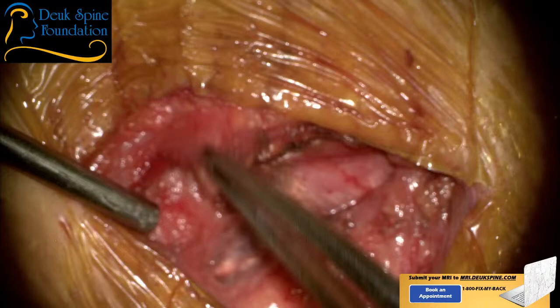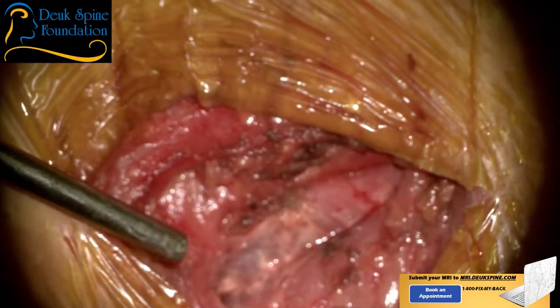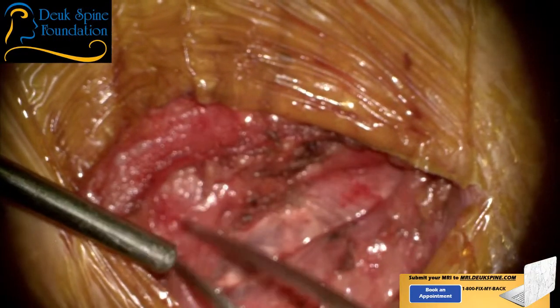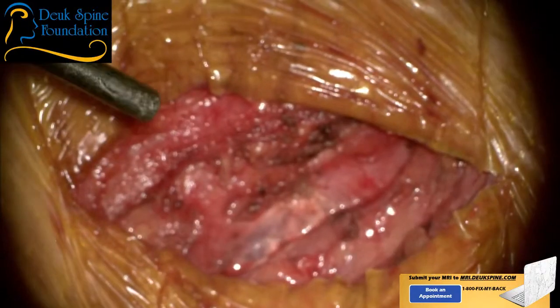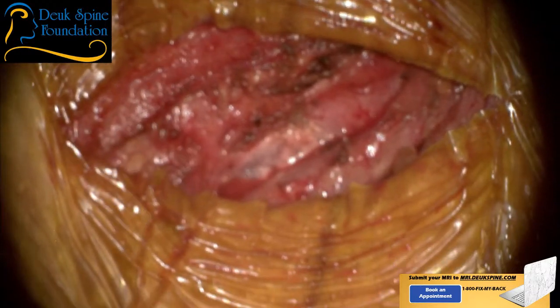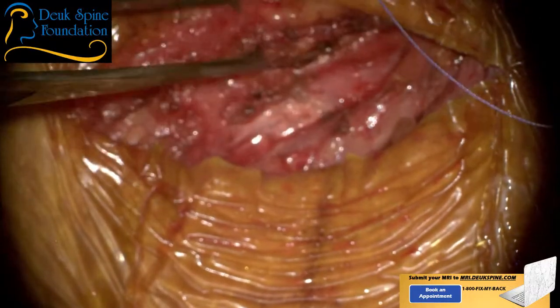This is the platysma muscle. He's got a nice, well-developed platysma. We're on the surface of the sternocleidomastoid, again, the omohyoid, all the rest of the strap muscles. There's no bleeding. We probably lost 10 cc's of blood, the whole case. All right, let's close this. Nice job, Luis. So we're going to close the platysma. Dr. Patel, you want to do this?